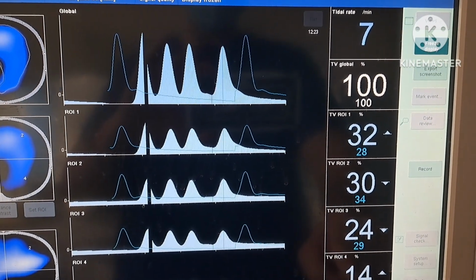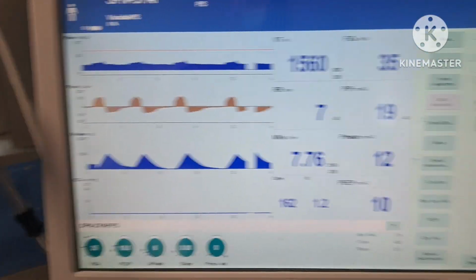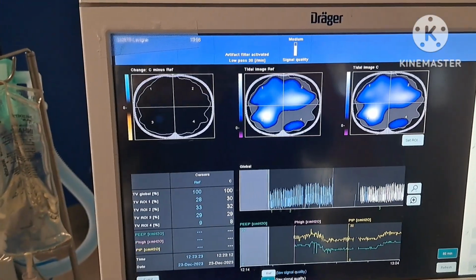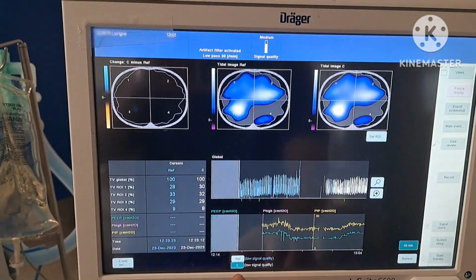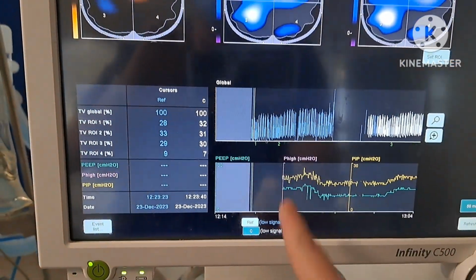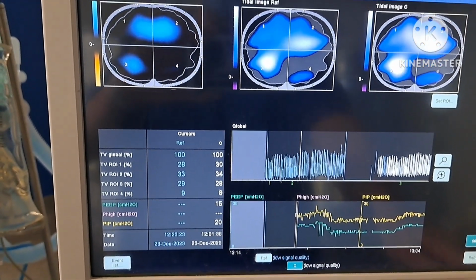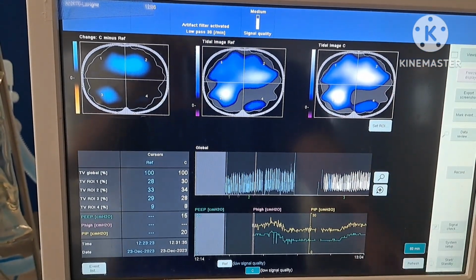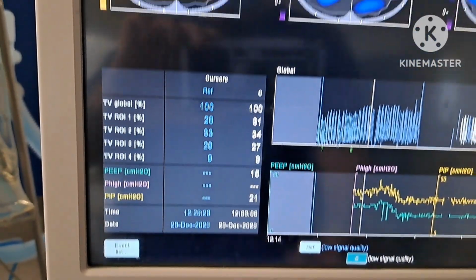We've increased to a normal amount with 10. So I'm going to do the PEEP titration. Okay, so I think we've found the Goldilocks PEEP setting. If we look at the control we had started, unfortunately I wasn't connected to the Drager vent, but then I caught on. But by then we were at a PEEP of 14, okay? Do you remember when I was saying nothing much is happening here, even with the higher PEEP up to 16. So it hovered there, and notice we have a PEEP still at 15.